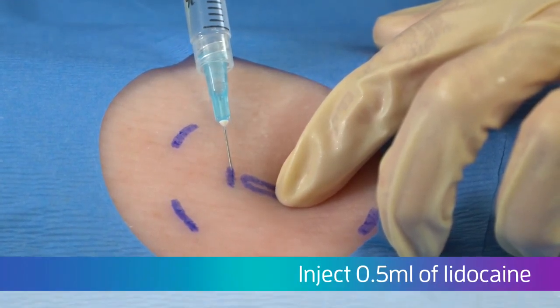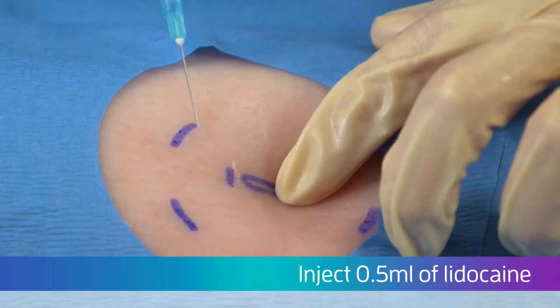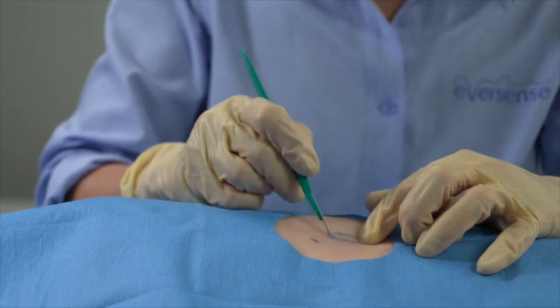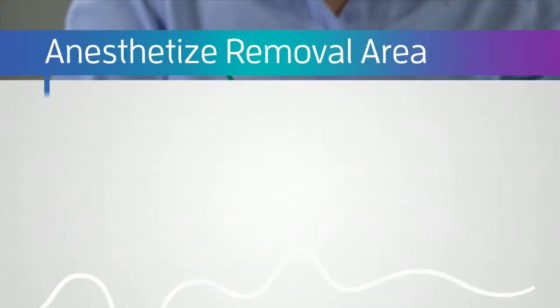Inject 0.5 milliliters of lidocaine at the planned incision site while slowly withdrawing the needle. While continuing to maintain contact with the sensor's proximal end, check that the removal area is fully anesthetized, which typically takes 1 to 2 minutes. With the tip of the scalpel, tap several points of the planned incision line and removal area.